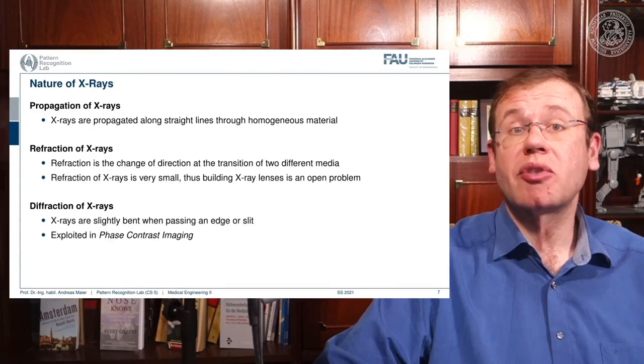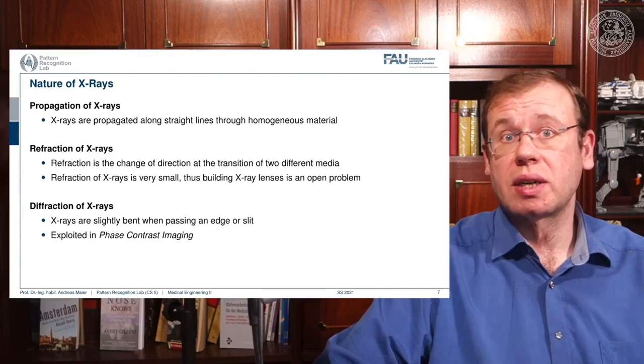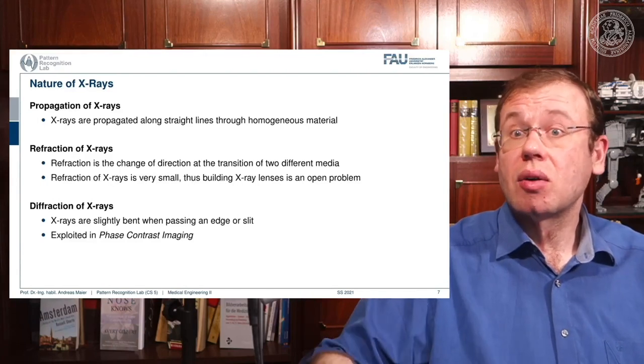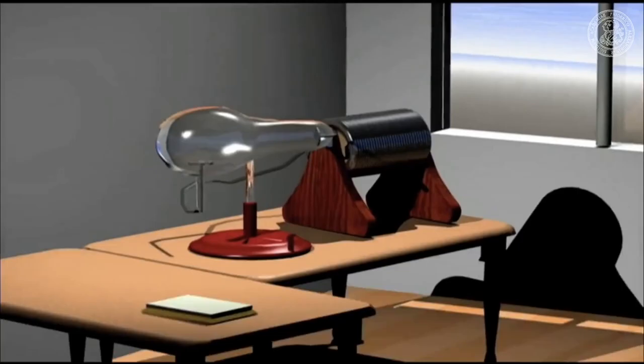But this is something that we'll talk about towards the very end, when we have already explored the X-rays and the different ways of using them. So something to come later, but I think it's a very important point that you also understand the diffraction of X-rays.